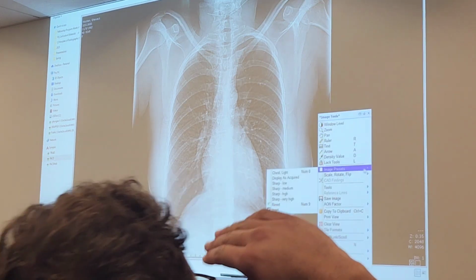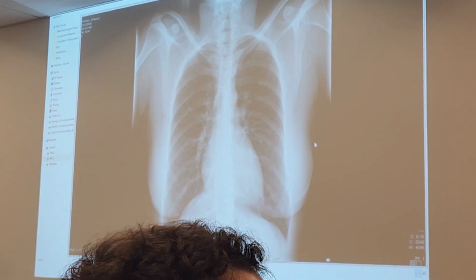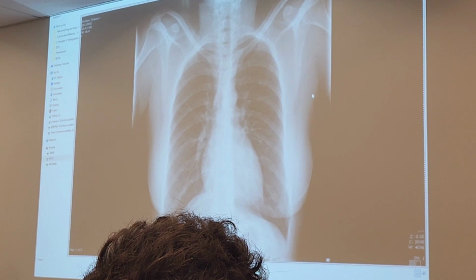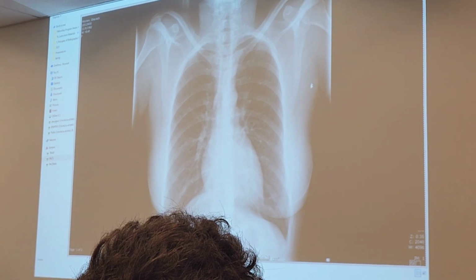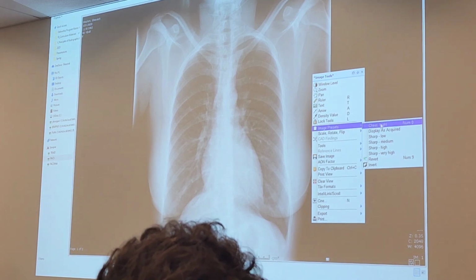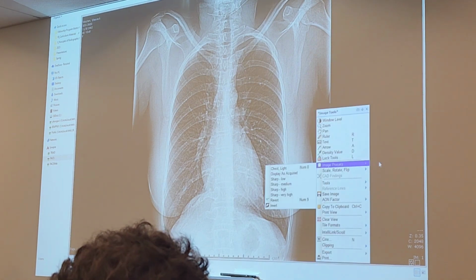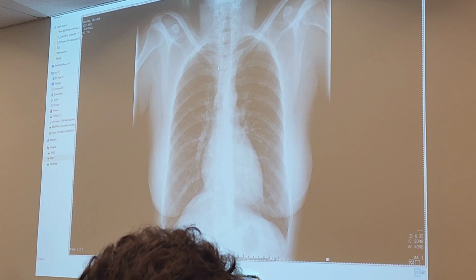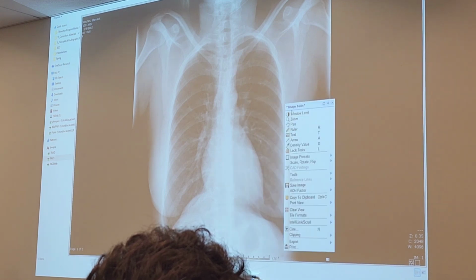So it's basically making the image clear? It makes the edges of anatomy look more clear. Sometimes you don't necessarily want the edges of your anatomy to be clear. Sometimes you want to be able to see the fuzz. But if you're trying to figure out where this bone is supposed to be, and you can't quite see it, sharpen it up. For example, something like the SC joint. You can kind of see the sternum, the manubrium right here. But you take this and you sharpen it up.